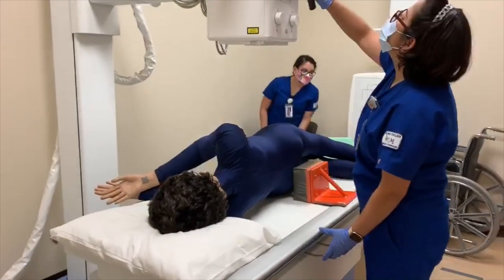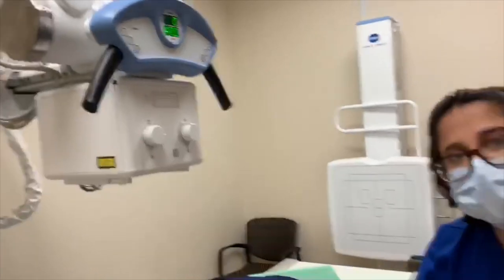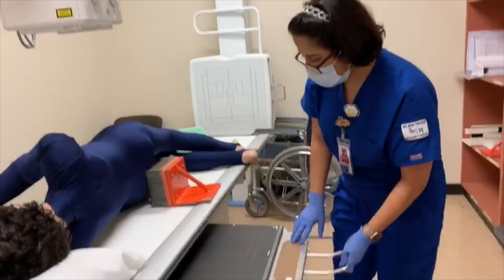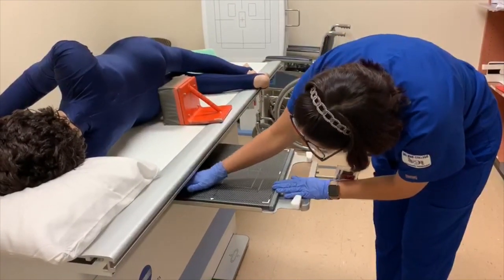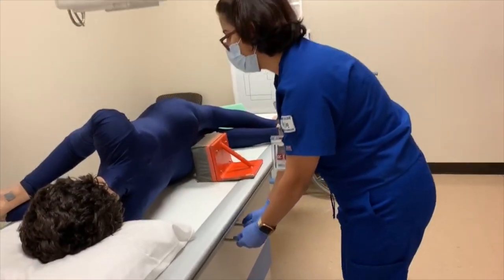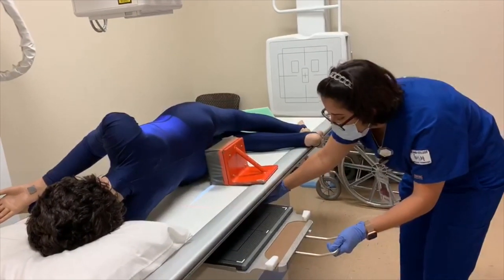Then you want to keep your SID at 40, as we did for the other projection. Your kVp is going to be the same, 90 to 95, depending on your patient. Swapping out Camille's left, I'm going to put mine. Make sure that it's still aligned. Moved a little, so we'll just adjust it.